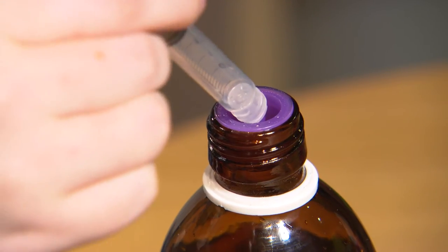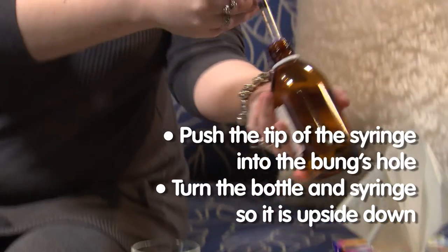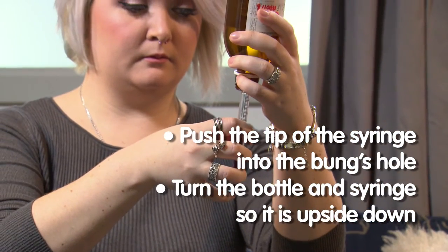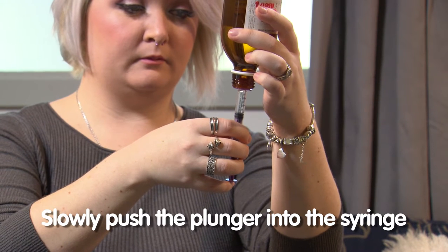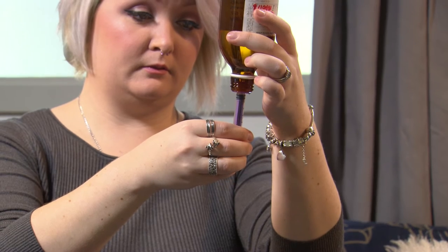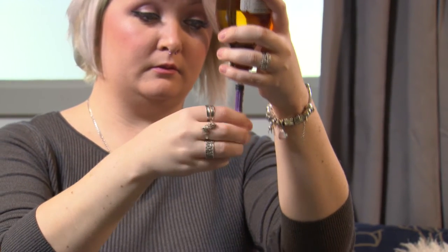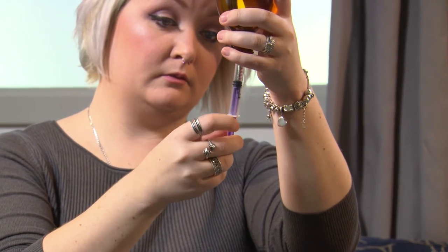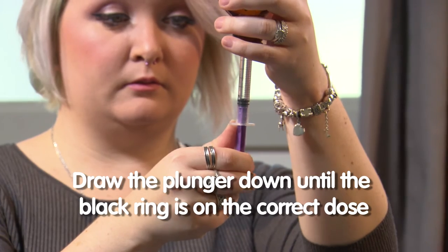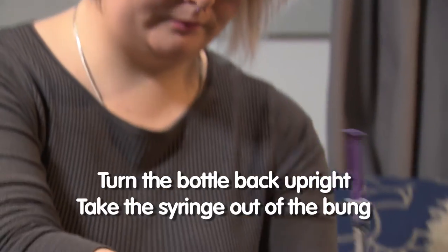Push the tip of the syringe into the hole in the middle of the rubber bung. Turn the whole bottle with the syringe upside down. Slowly push the plunger into the syringe — this will push air into the bottle. Pull the plunger back until you've drawn the right amount of liquid into the syringe. In this case we are using 2.5ml of medicine.